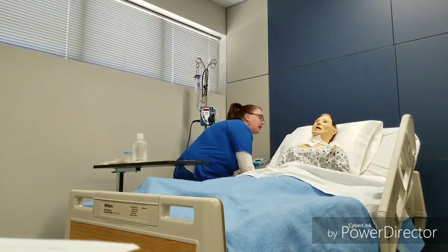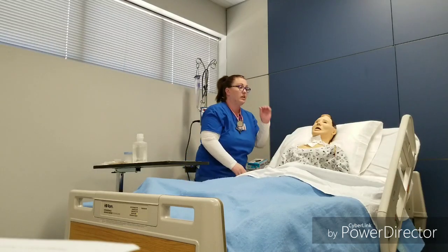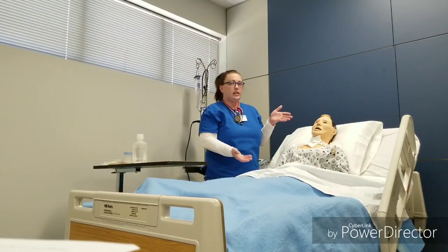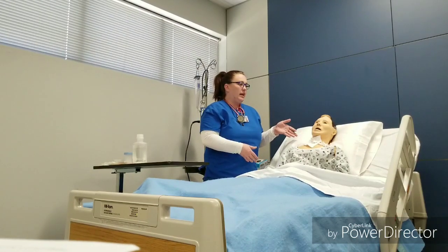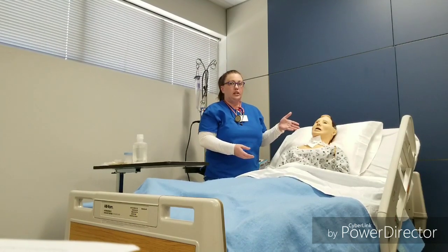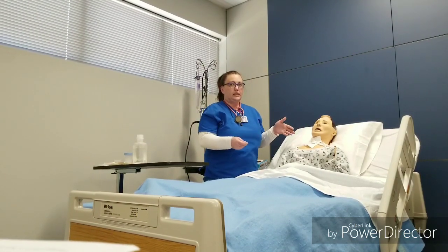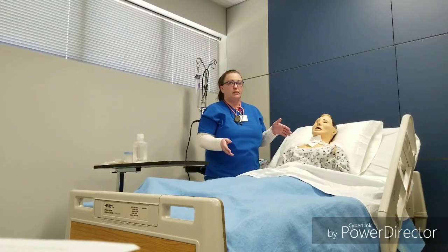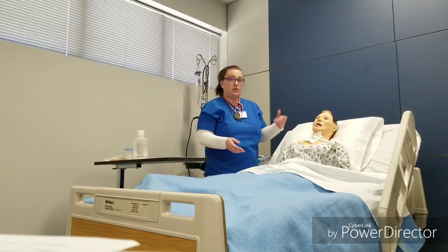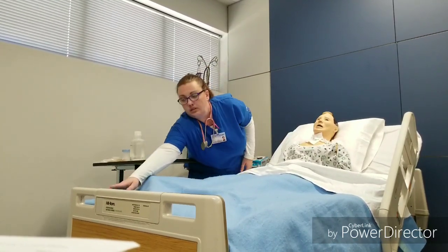Make sure that you put those back up before leaving the room. You want to make sure your patient's head is elevated if they're lying flatter, and you want it up pretty high. And you want to remember when suctioning to give breaks in between each suction and don't go more than 2 times into the nose, because you're also taking their mucus, but you're taking their air also. So you want to assess.